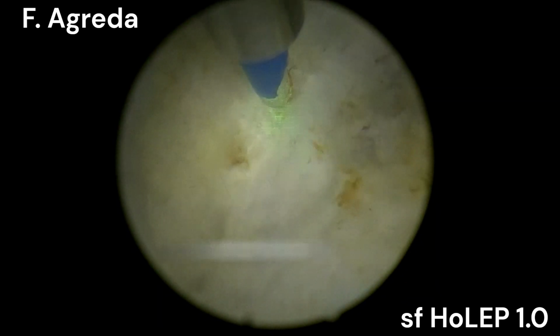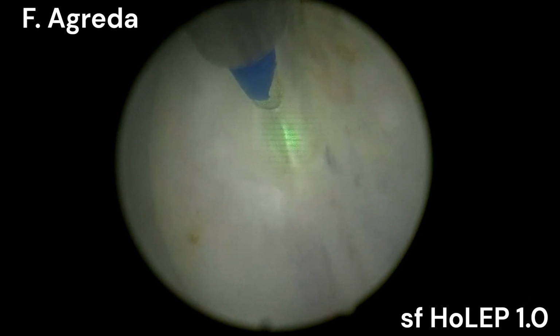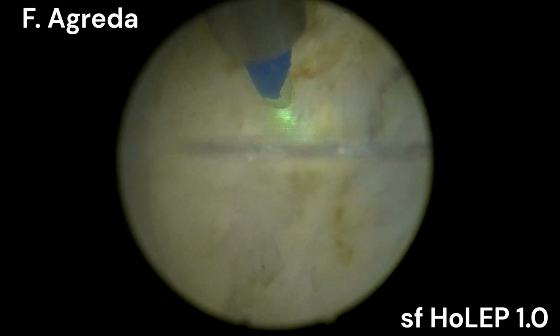Here you can see how the laser is applied to the interface between the adenoma and the capsule, and there's almost no bleeding here. This patient got a prostatic artery embolization 6 months ago.